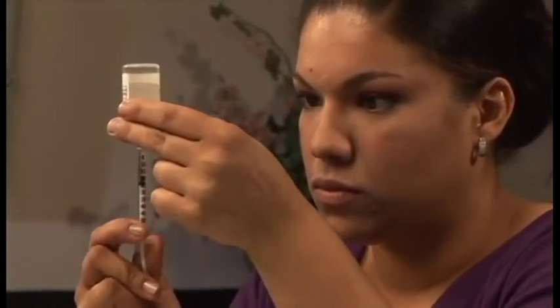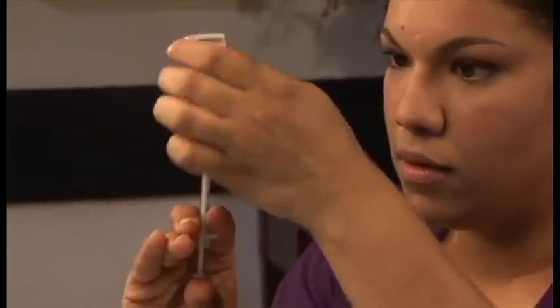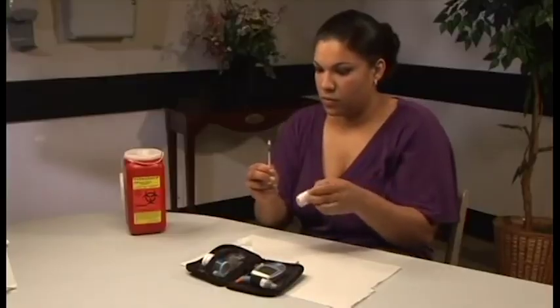Pull the plunger back until you have the proper dosage of your prescription. Make sure to tap out any bubbles, push the air bubbles out with the plunger, then refill the syringe with the proper dosage of insulin. Pull the needle out of the bottle and don't let it touch anything.